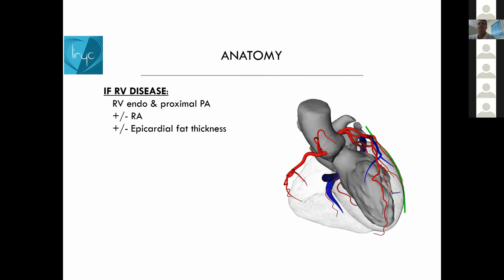In right ventricular disease, we did an ARVD case just last week. The CT was actually not available, which is frustrating. It had been done, but was not available just due to some informatics issues on our end. We did it the traditional way, but I sure missed it because it's nice to be able to see the RV marginal branches coming off this right coronary artery, which runs along the AV groove and the tricuspid valve and sends those branches out. Visualizing fat can be helpful.